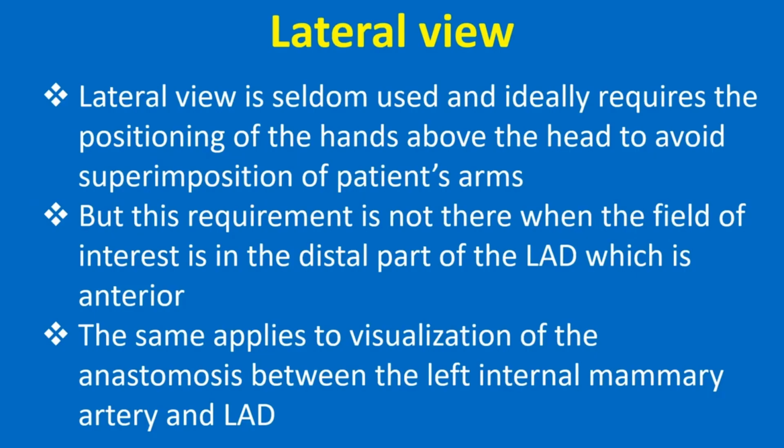Lateral view is seldom used and ideally requires the positioning of the hands above the head to avoid superimposition of the patient's arms. But this requirement is not there when the field of interest is in the distal part of the LAD, which is anterior. The same applies to visualization of the anastomosis between the left internal mammary artery and LAD.